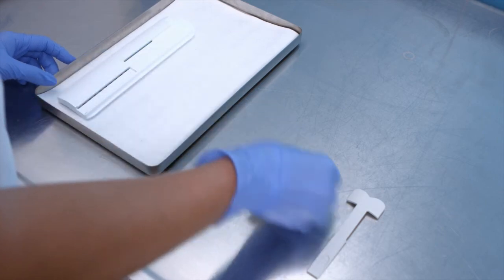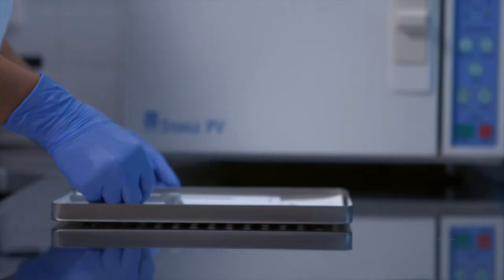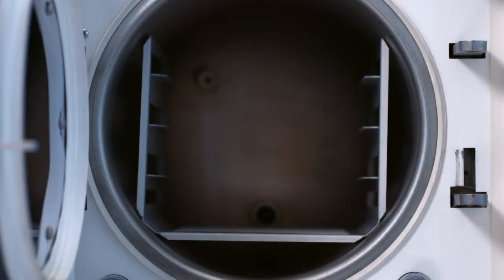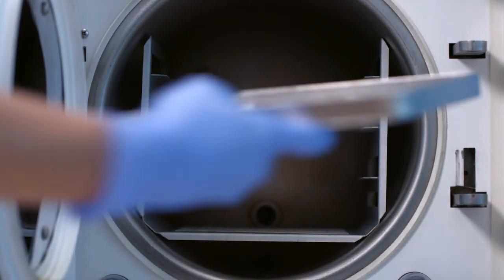Sterilize the instruments and Shade Guide immediately after use in an autoclave for 5.5 minutes at 134 degrees Celsius, using the pre-vacuum function.